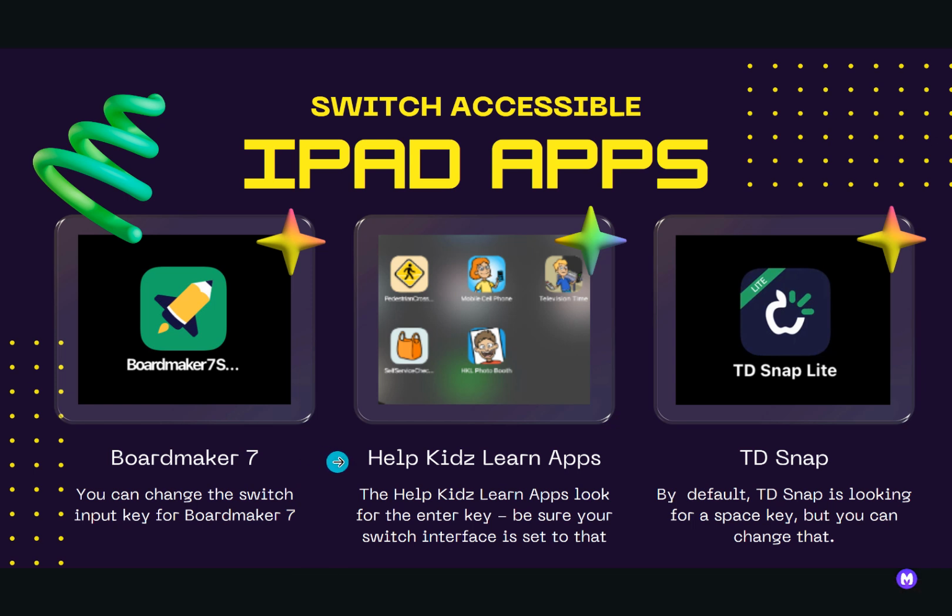Now, the apps by Help Kids Learn are very simple cause and effect apps, great for starting out, and many of them are very age respectful if you have transition age students learning to use switches. But the Help Kids Learn apps are looking for the enter key. So be sure that your switch interface is set as that.